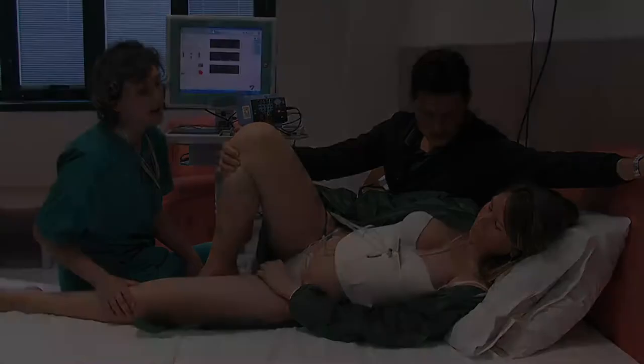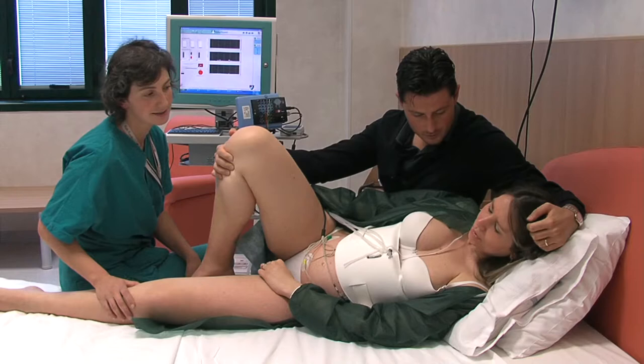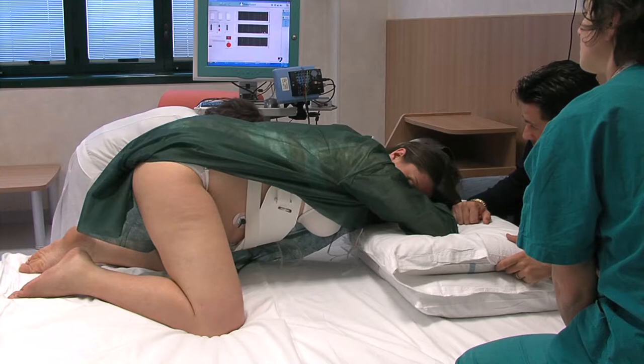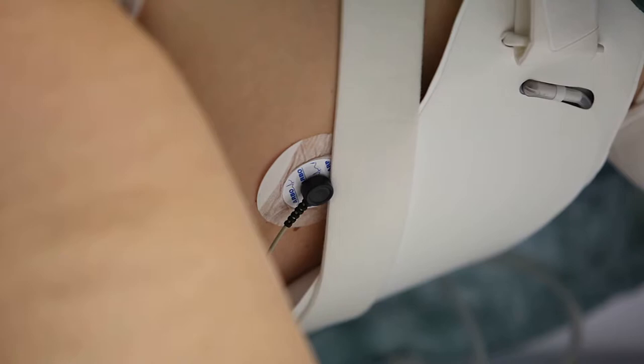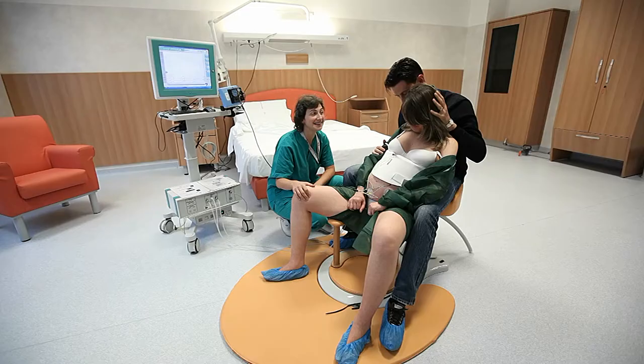Le posizioni della partoriente possono essere le più varie e libere: la classica posizione supina, quella a carponi. In questi fotogrammi si può evidenziare un particolare nel gonfiaggio della fascia. Adesso vediamo la partoriente appoggiata al marito insieme all'ostetrica.